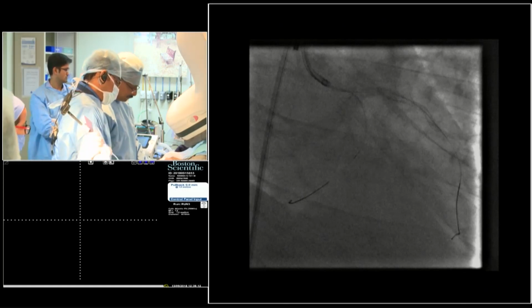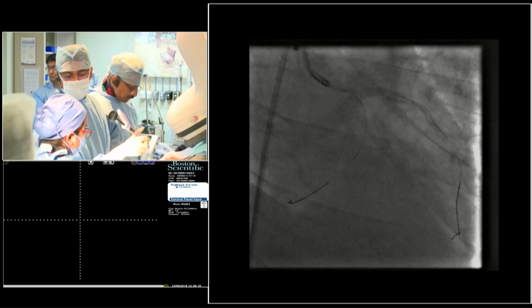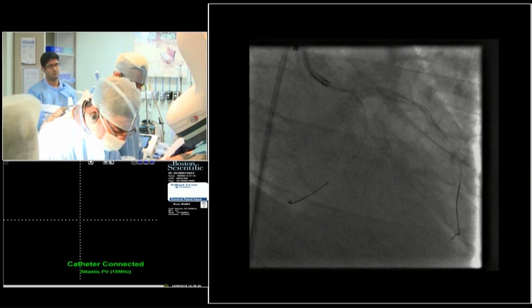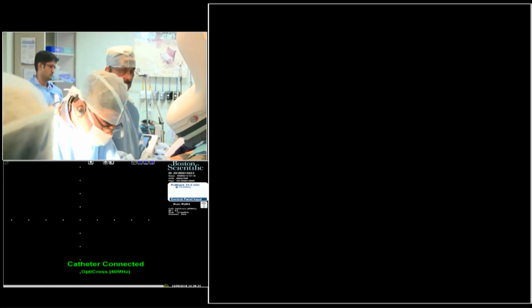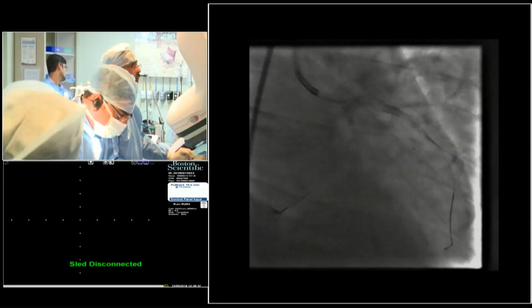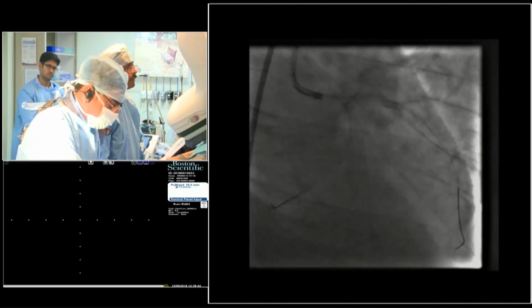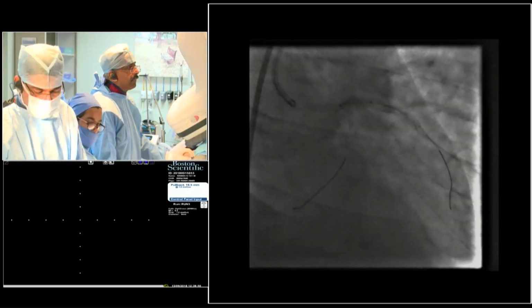So we have taken the 3 millimeter balloon. Keep the IVUS ready, sister, and keep a 4 millimeter balloon. We'll do a 4 millimeter, then do the IVUS, and I'm done. Sister, hold that. Come here, sister. 4 millimeter balloon please, sir. 4.8.